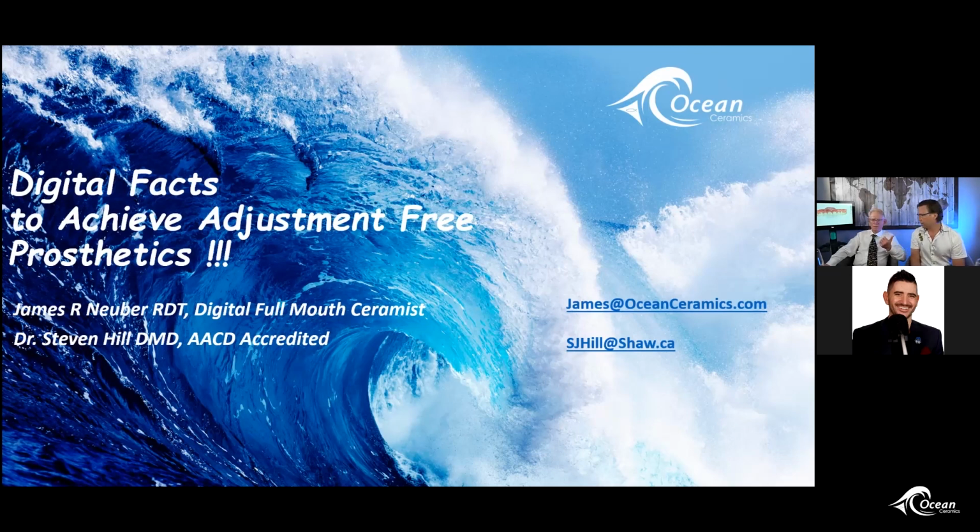To add to the answer to the question, the makers of the materials, some are not as consistent with their testing of their materials. And so to say, is putty better than a heavy body? Well, maybe putty from Honigum is fine. Maybe putty is different than the Honigum from some other manufacturer. Sometimes you just can't get that information. It's the companies themselves that invest in that time and effort to present that to us. And that was about the only one you could find that day, one that had consistency across the formulations of the materials, but consistency with the stone as well.